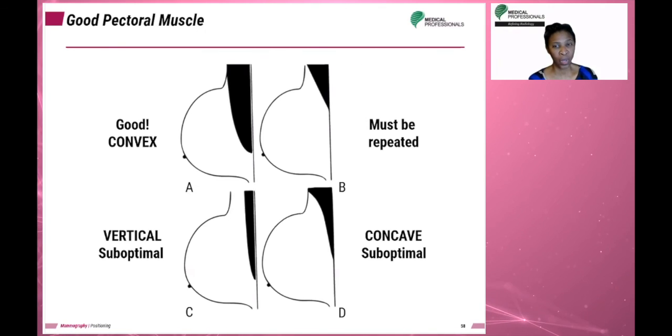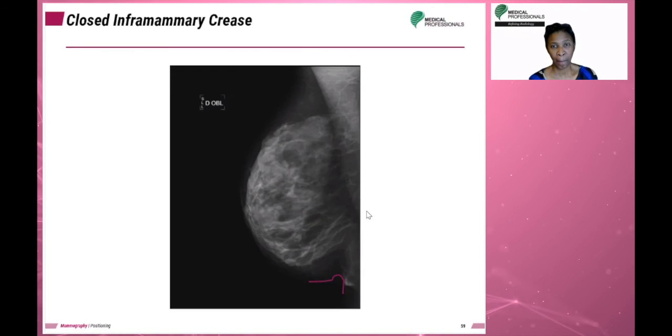One thing of note with these: although this is not necessarily repeatable, this is not something you'd want to submit to the ACR. The fold must be open on the MLO. Again, is it possible on every patient? Absolutely not. But you do want to try to get an open fold. If you don't have an open fold and there are a lot of skin folds covering your fold, you may want to do the mediolateral. That usually clears it up.